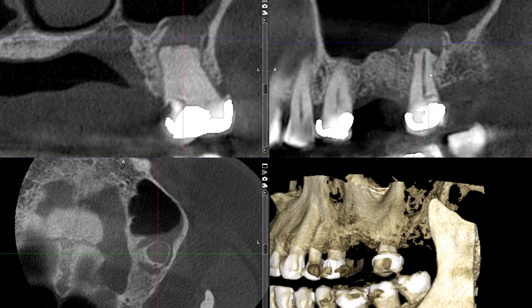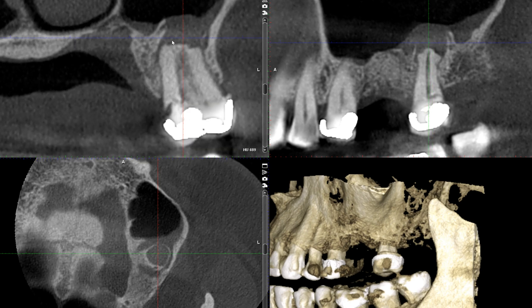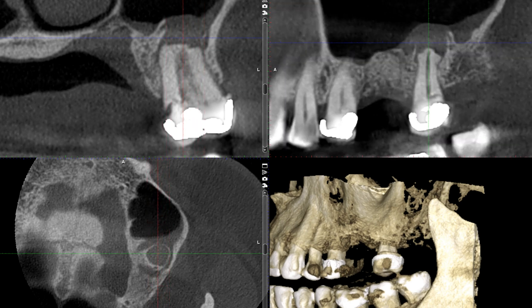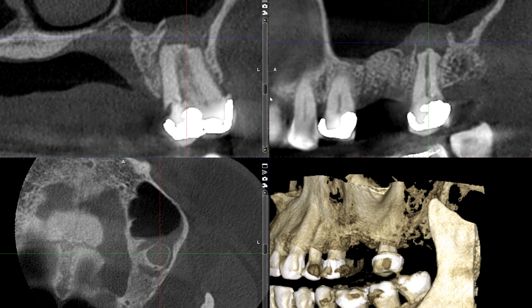A couple of things to note: there is significant resorption of the root. That's not a typical root anatomy or morphology for it to end so bluntly as shown here. The way it has been resorbed tells me that there has been infection or inflammation in this area for quite some time.